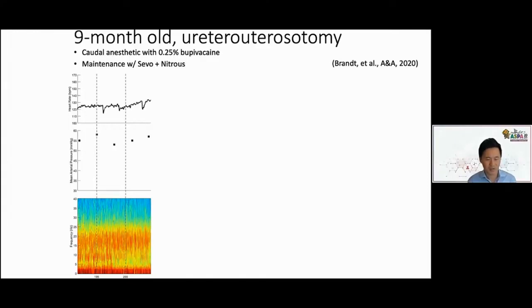Okay, so what do we see here? I'll just pause, maybe reflect on this. Okay, so just take note of the heart rate, blood pressure. So let's scoot forward another 10 minutes. Okay. And again, there's no change in the sevo or nitrous, that's just being maintained.